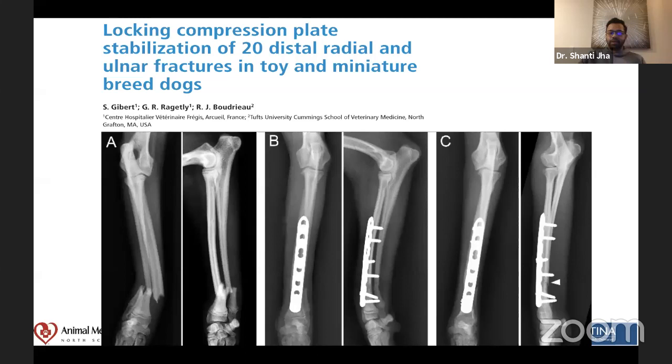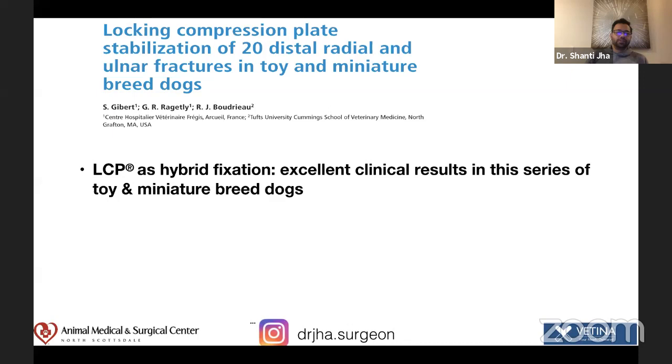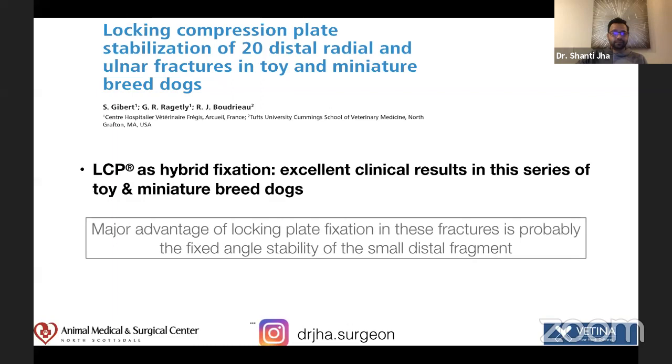They had this report of 20 fractures, using locking versus non-locking and hybrid, and the results were pretty good, everything healed. So the point I was trying to make is that you can use the locking plate system as hybrid fixation, or you can just use general plating also. I'm not trying to drive all of you to go and use just the locking system. But again, for us humans, if the new technology is available, why not? We should use it if it's going to cause more efficiency and better healing. Hence, I use the locking plate system, not just because it's fancy. Of course, it's fancy.